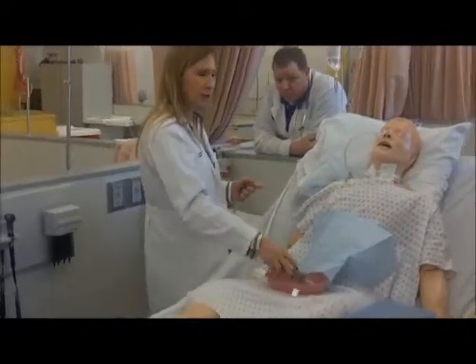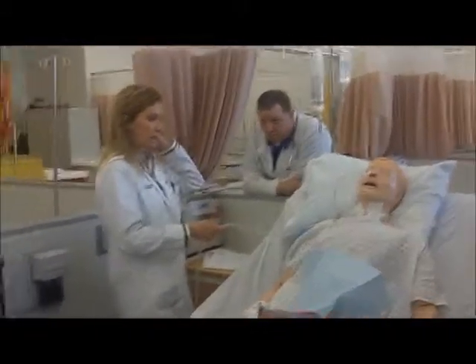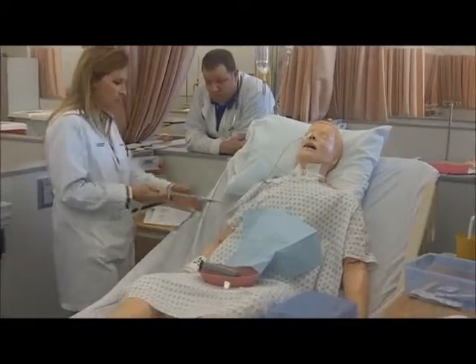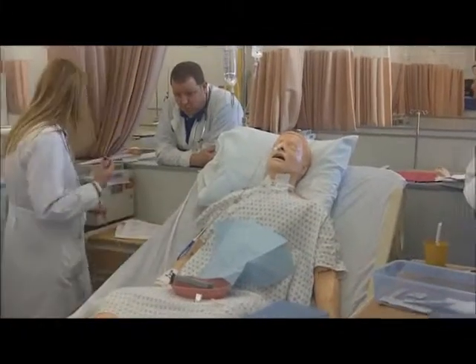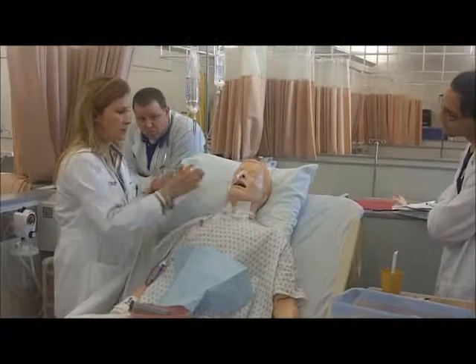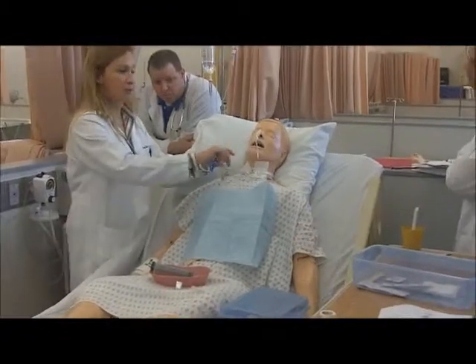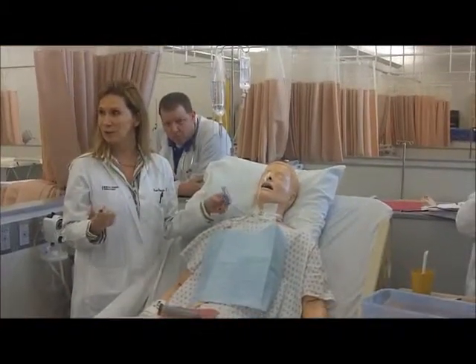Suppose we have to discontinue, because that's one of your competencies, disconnecting the NG tube. So how do you think you would do that? Turn off the suction. Clamp it, turn off all this, get this out of my way. Take off my tape here, explain to the patient, towel. And they say what you should do is put this in a towel when you're pulling it out so they don't see the gastric juices.